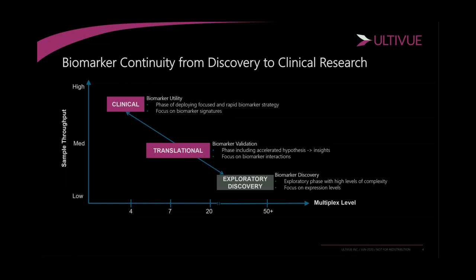Now that you found those biomarkers that you have validated in that translational portion of your studies, now you have to assess the utility of these biomarkers. What does that mean? Well, now that you've gotten these biomarkers, you want to assess if they really are good signatures by themselves when you apply them to patient cohorts and correlative studies and clinical research, for example, but also can you deploy it, right? So can you give this to your CRO partner if you're a pharma? Can you give it to your partner lab down the street, maybe even down the hallway? You want to make sure that whatever results you get from the lab where you've originally done this work can also transfer over to any other place in the world, essentially.